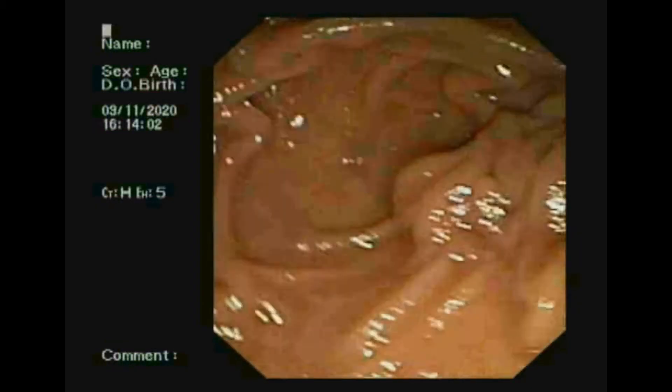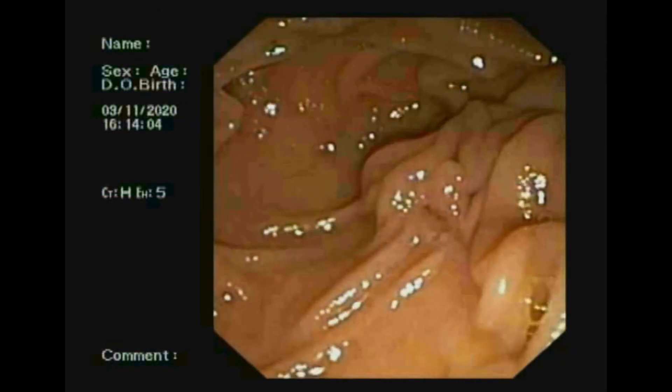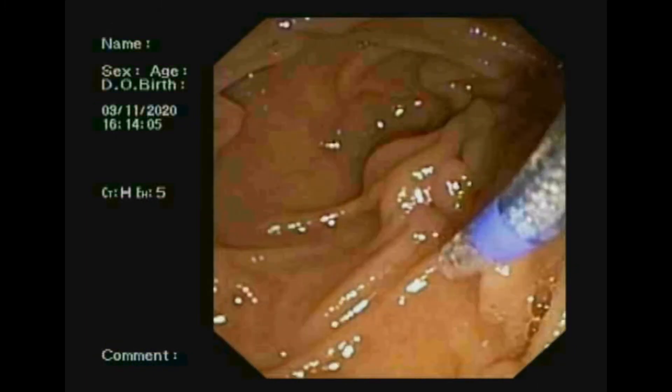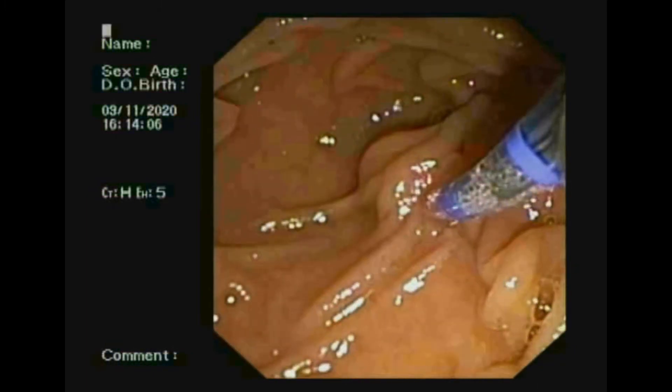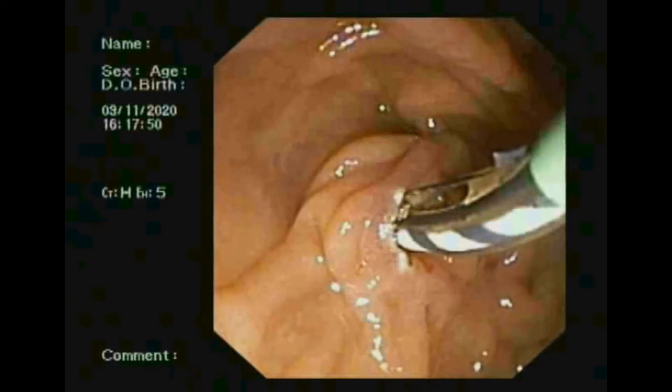The duodenoscope showed a floppy papilla. We then performed selective biliary cannulation with sphincterotomy over the guidewire.